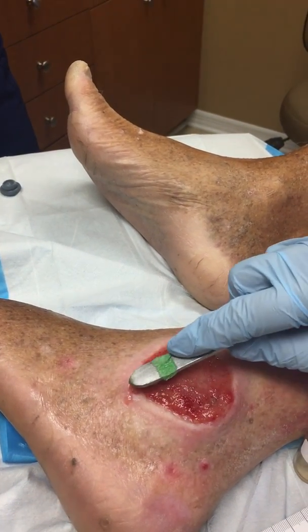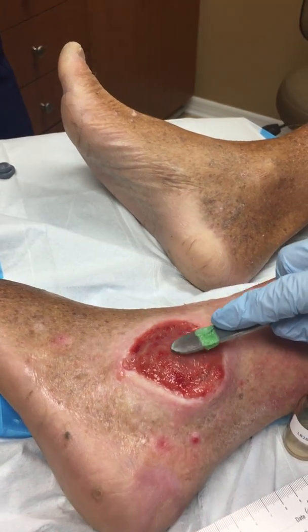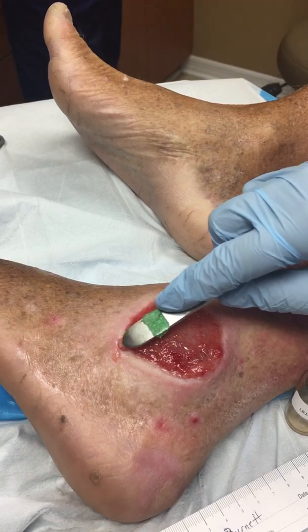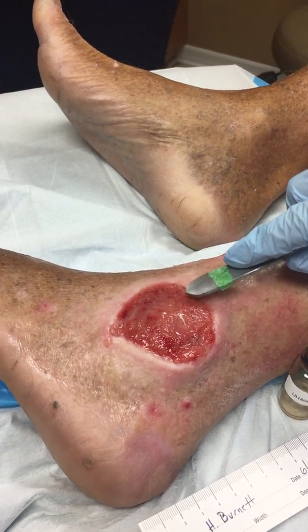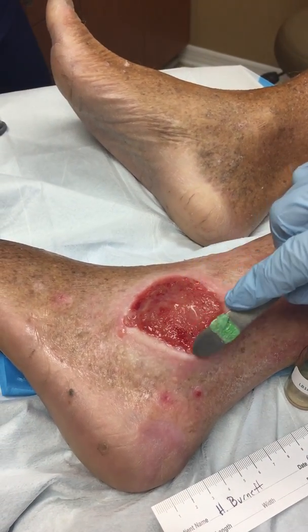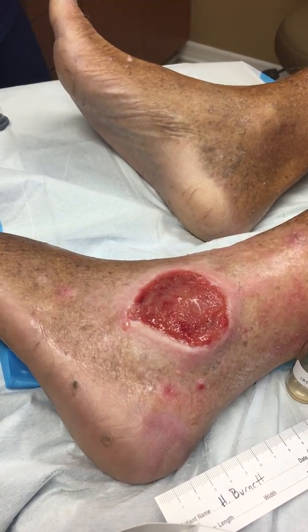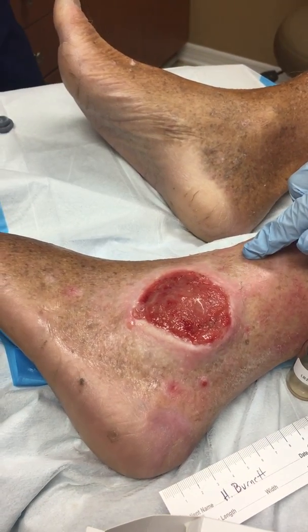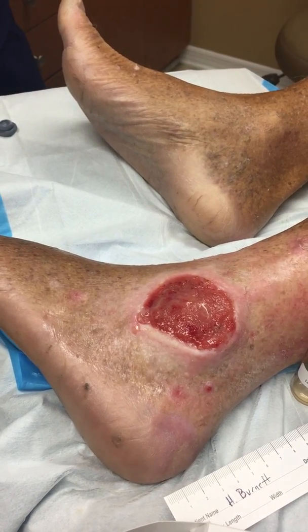I'm not sure if it's picking up on this video, but from here you can kind of see the glistening of the placental piece. I know that we've got all of the edges touching and covered, and hopefully that will help out.